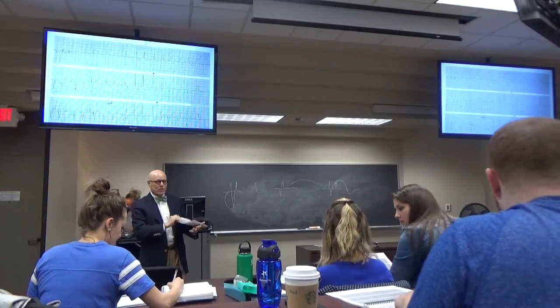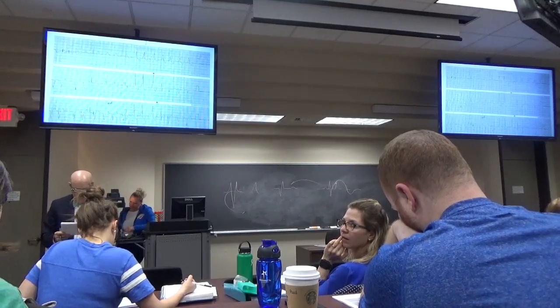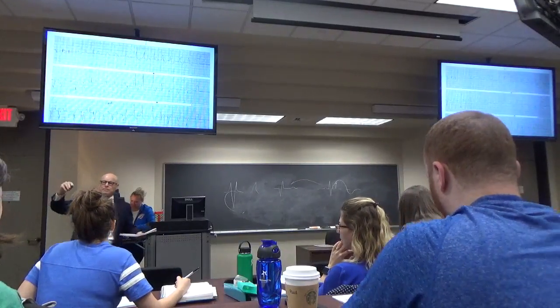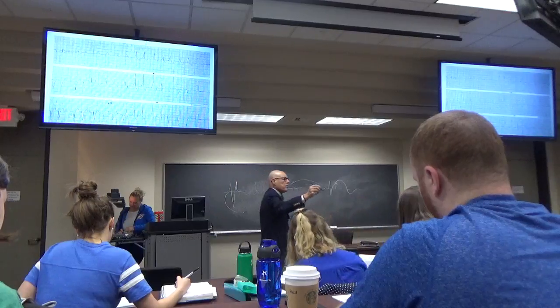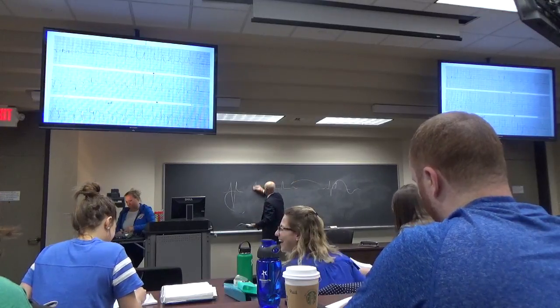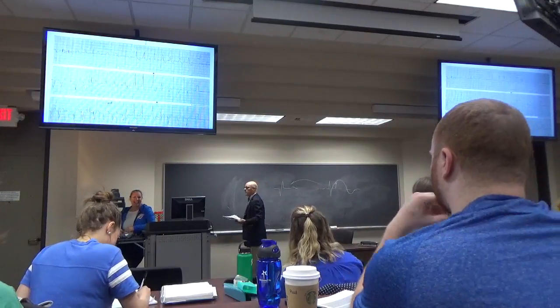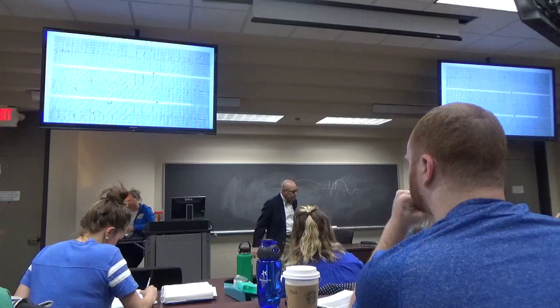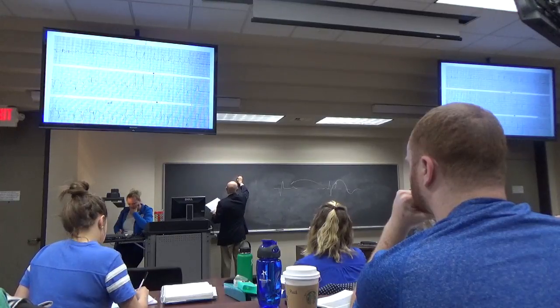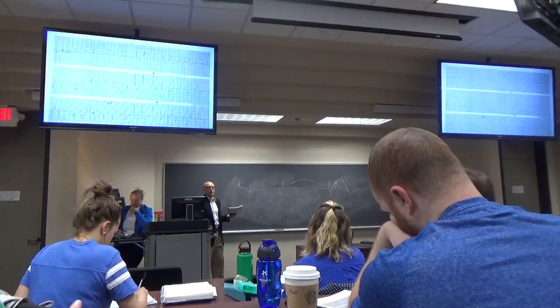Any other questions? I thought there was some anterior septal ischemia on this one because the T waves are upside down. Yeah. What's the T wave rule in a bundle branch block? It doesn't matter? Everything matters. They're opposite in direction in every lead. If you have a bundle branch block, the T waves need to be opposite in direction to the last portion of the QRS.